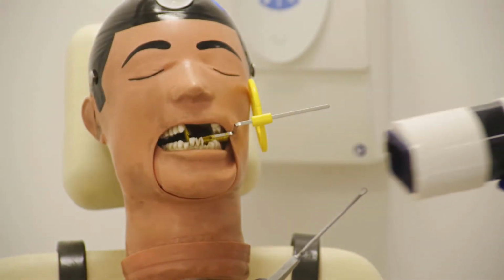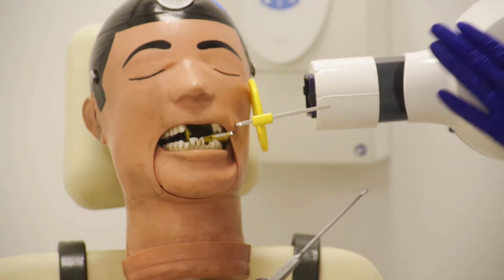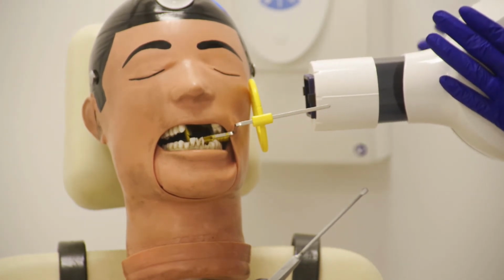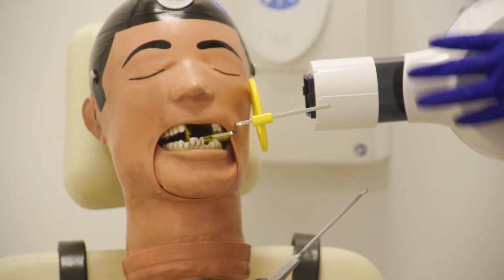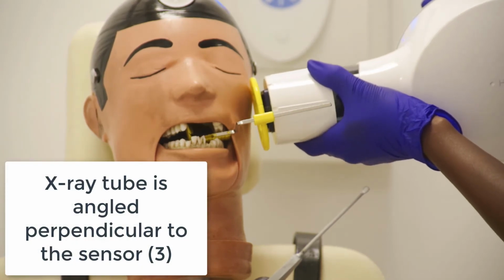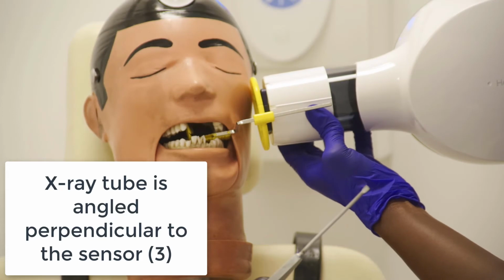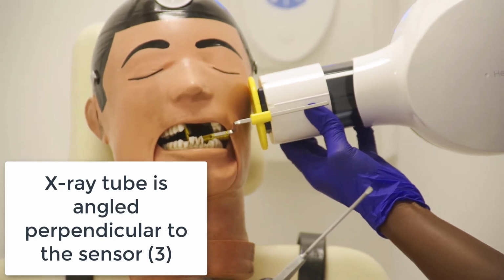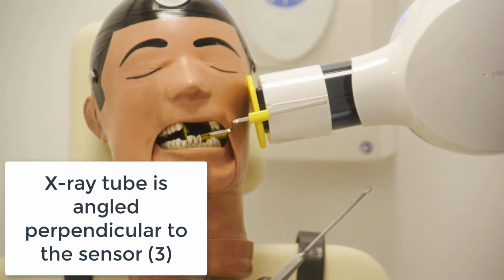We want to bring this device as close to the cheek as possible to prevent divergent magnification of the image that's produced. And also from the lecture, you remember we said that you assemble your X-ray tube so that the horizontal and the vertical angulation are correct. You want to bring this X-ray tube perpendicular or at 90 degrees to the receptor in the tube. And this is what I'm going to do now. So if you look at it, you can see this line is parallel to the metal.